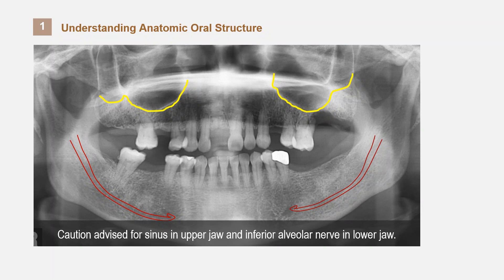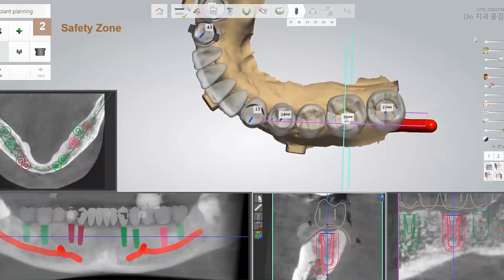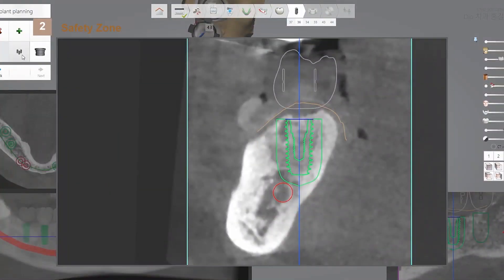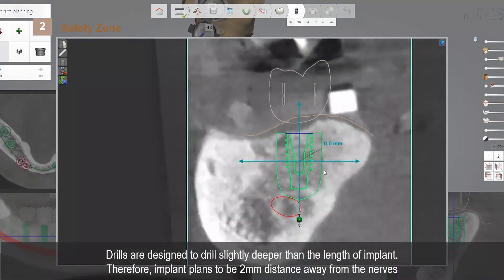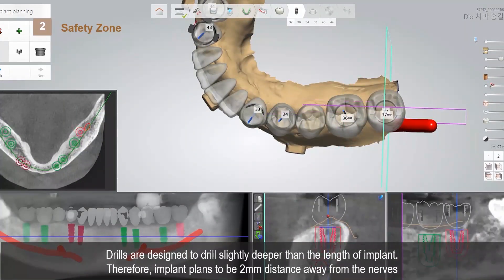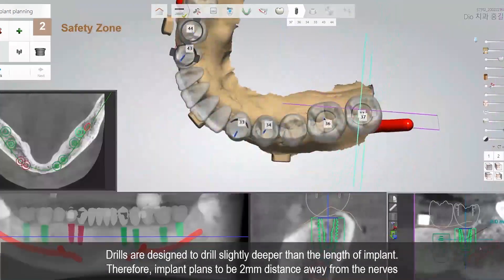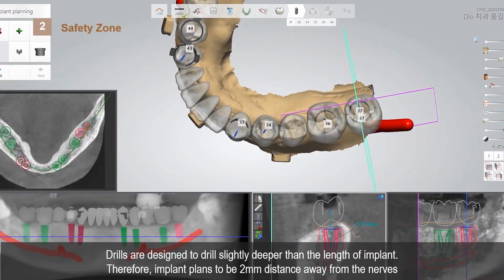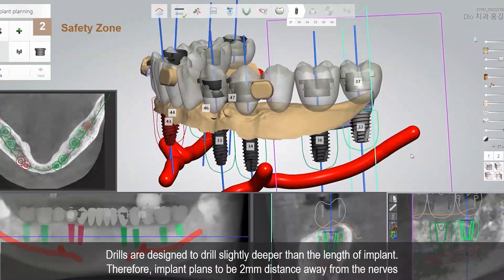If the patient was left for a long time without any teeth, they might only have the basal bone left due to absorption of the alveolar bone. Alveolar bone absorption means that the available bone for implant placement has been absorbed, so there may only be residual bone very near the alveolar nerve. As you can see in the video, in the implant studio, there is a safety distance around the fixture. The safety distance around the side of the implant is 1.5 millimeters, and the safety distance below the implant is 2 millimeters. This is because on the mandibular bone, you need at least 2 millimeters of safety distance from the alveolar nerve, and you can place the implant based on this setting.